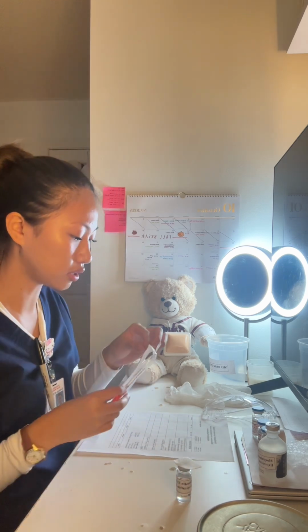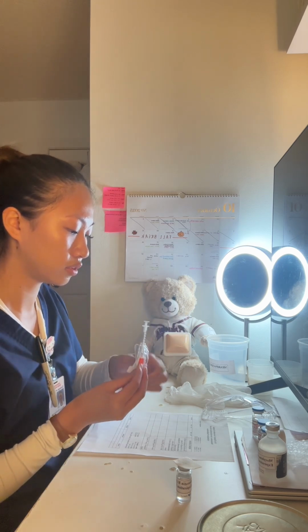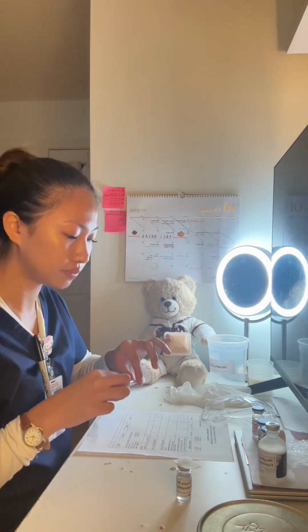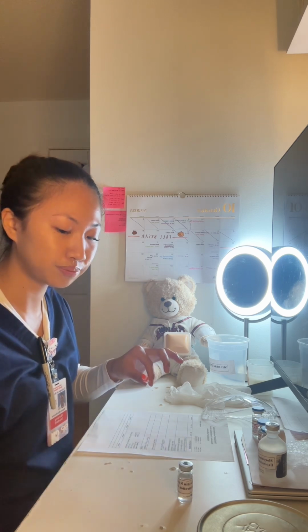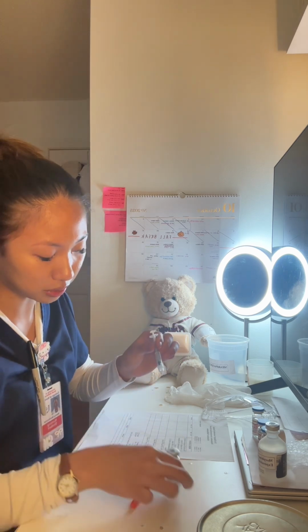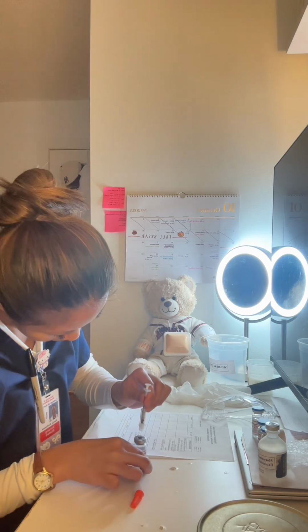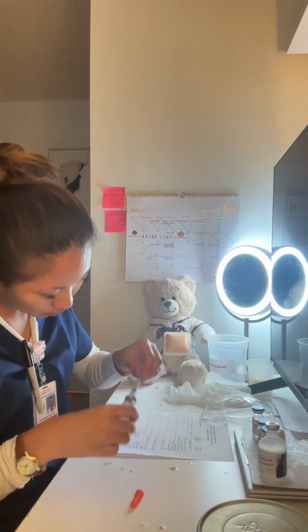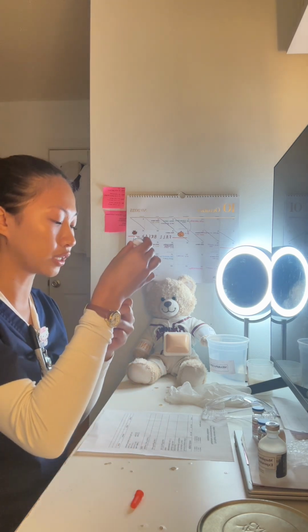And 10 units, so take that. Gonna take this off here, uncap this, and then I'm gonna go straight down and pull back 10 units.